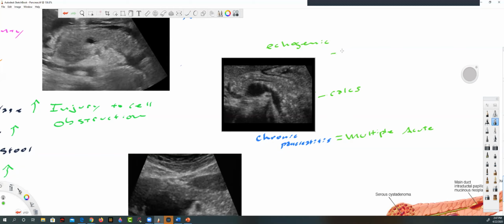Oh, and they tend to be small. I've seen them where they are so small, I can see it, but I can't believe it. It's so thinned out. Small, another word for that is atrophy or atrophic. Cysts or small cysts are possible. Those could either be retention cysts from the previous attacks, or a small backup of fluid. And that was the last thing I want to say.